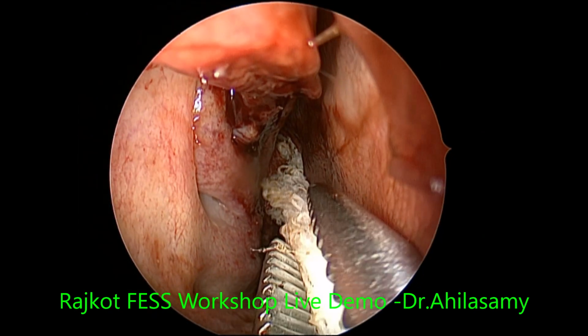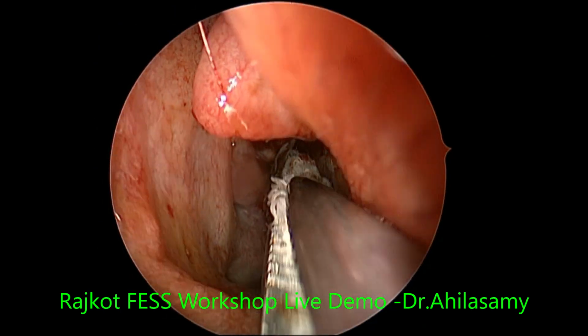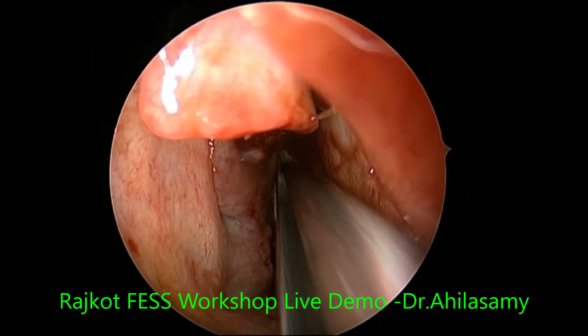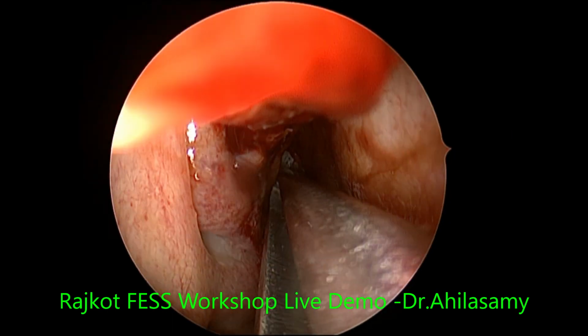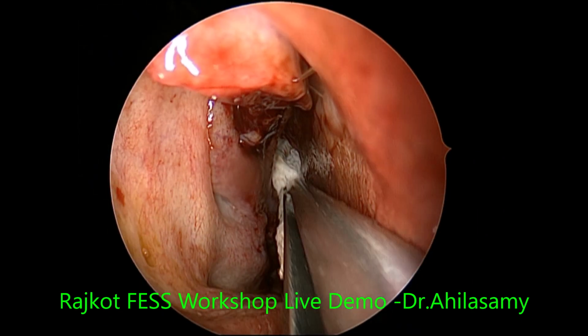Ahilasamy's wet mopping technique, and few instruments are there. Yeah, we have to put our names, man. Why are only these white people's names coming? We have this technique as the Gujarat dry technique.